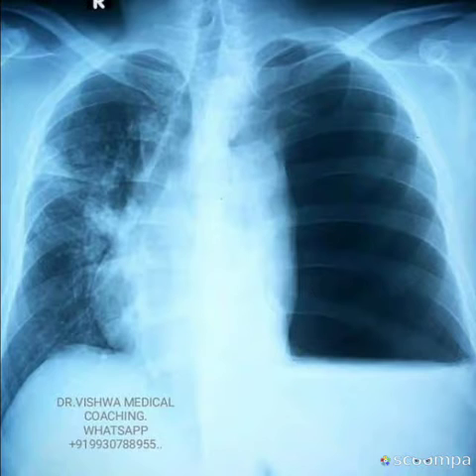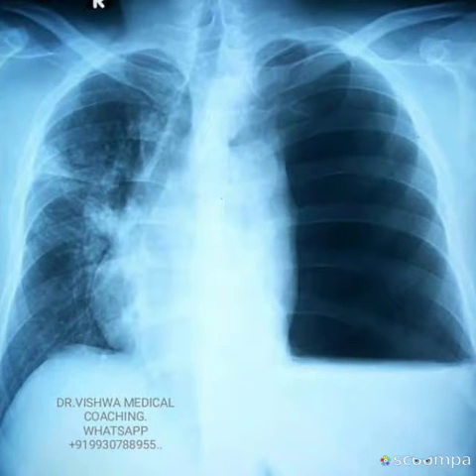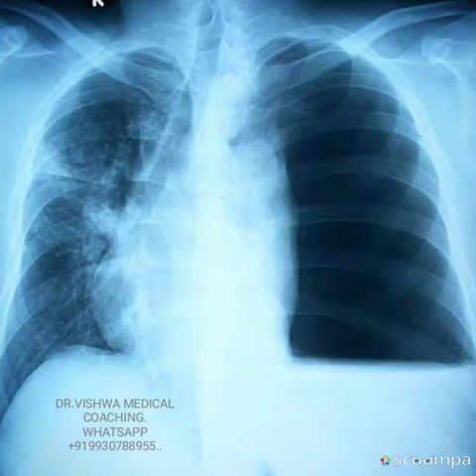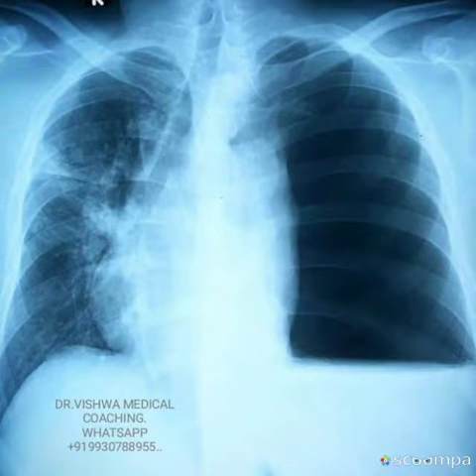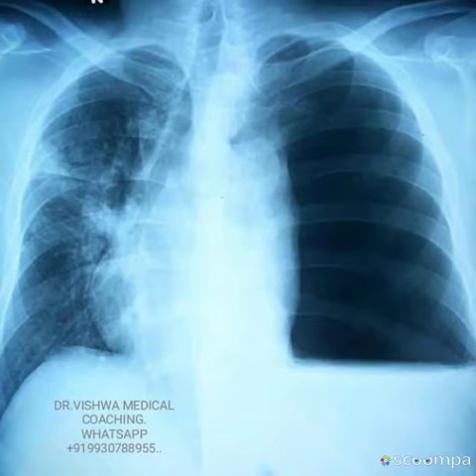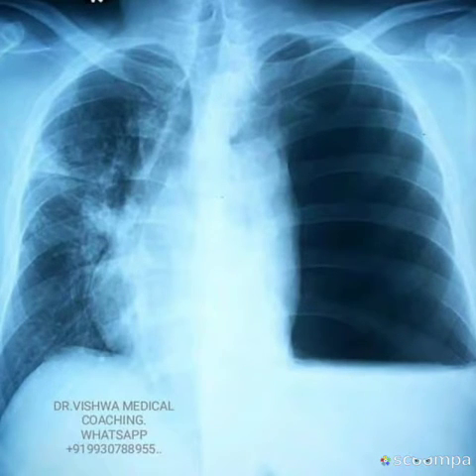If you compare the left-hand side lung field, it is completely black — jet black. Remember, lungs normally look grayish-black, not jet black and not grayish-white. So on the left-hand side there is only air but no lung tissue, which means there has to be a pneumothorax — and a huge pneumothorax at that.